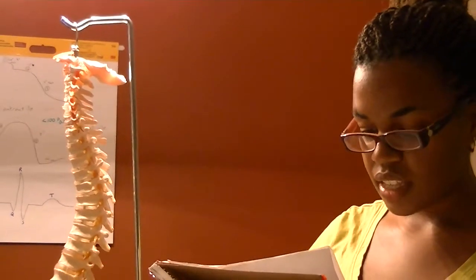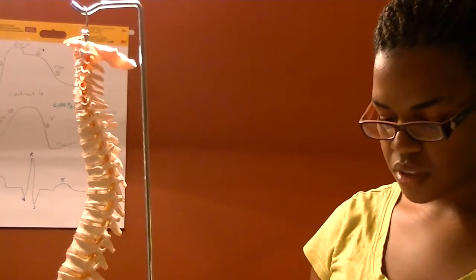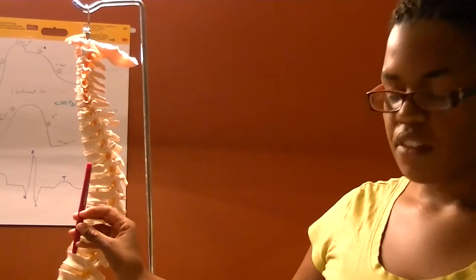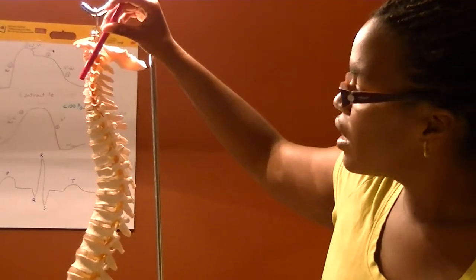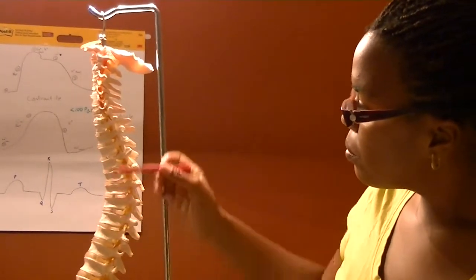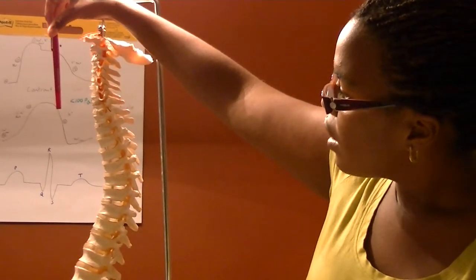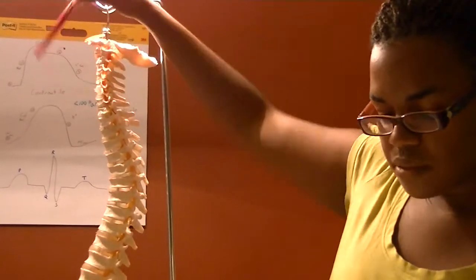The next and the last one is going to be the measurement of the prevertebral soft tissue. And this is going to be measured from the posterior aspect of an airway, which would be the trachea or the larynx or pharynx, to the anterior aspect of the vertebral bodies. So if this is my airway, I'm going to be measuring from the posterior aspect of this to my anterior aspect of my vertebral bodies.